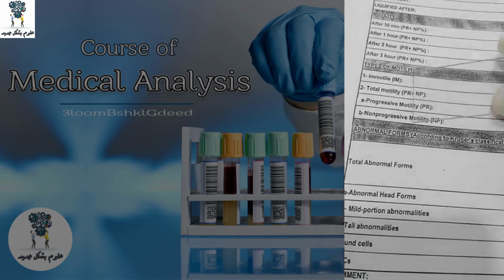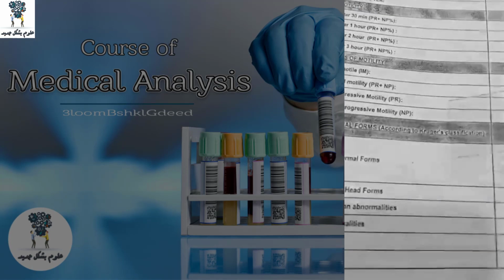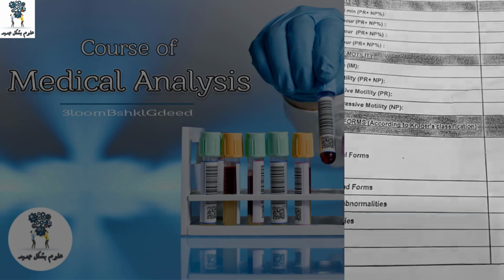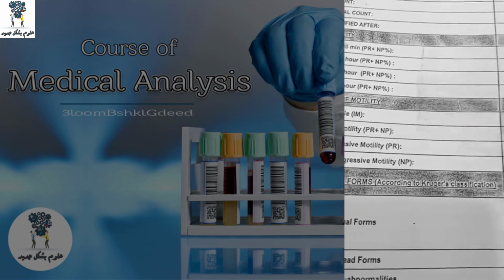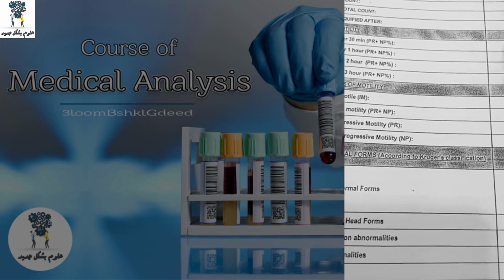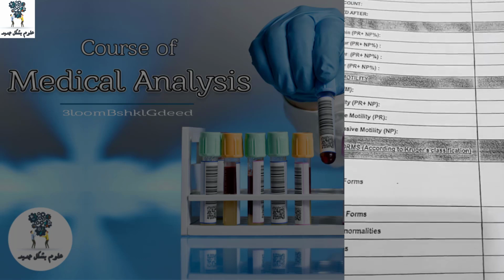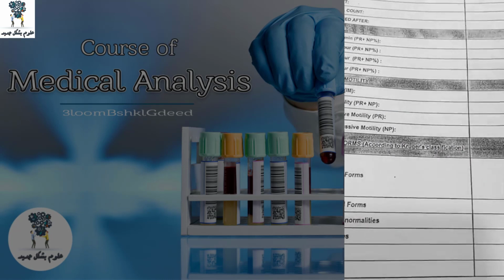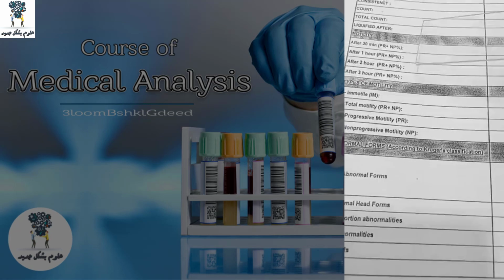في بقى تحت حاجة اسمها types of motility، يعني وصف دقيق للحركة. هو اللي بيتحرك حركة سريعة كان نسبته كام من 60%؟ كان نسبته 50%، كان most كلهم progressive. طيب النون progressive كان كام؟ كان مثلا 10%. أنا بعمل حاجة اسمها الجنرال موتيليتي أو الحركة الكلية للسبرمات، بكتبها سواء بنعملها calculation أو schedule. مع الوقت في المعمل بتعمل لها تقدير، ولكن في الأصل إنك بتقدر according لجدول معين. بتحرك الفيلد على الميكروسكوب وبتقيس الحركة لكل فيلد وبتجمع الحركة بتاعت الفيلدات كلها عشان تقيس البروجريسيف والنون بروجريسيف.